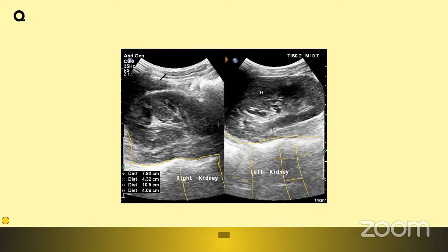If the ultrasound probe is going like this, it's hitting the fluid here, which is water, urine, and since this fat is much denser, with higher acoustic impedance, this can become hyperechoic. Yes, I agree to it. However, we did not appreciate this much hyperechogenicity deep to the kidney in any of the images earlier. So this is an artifact actually.